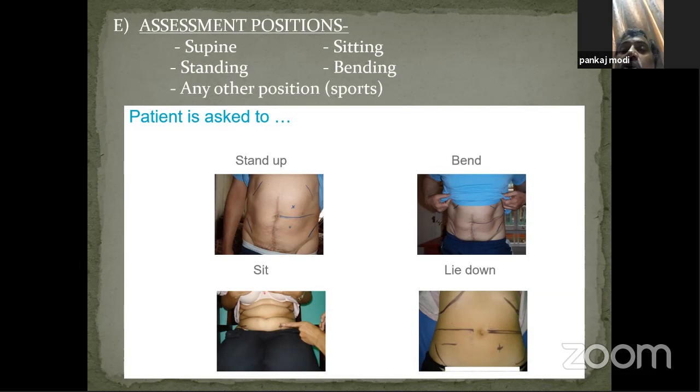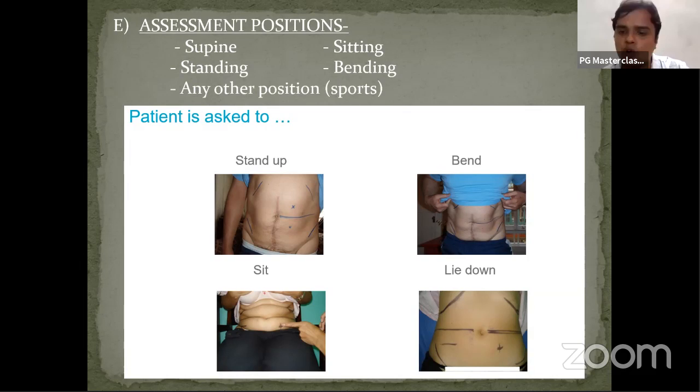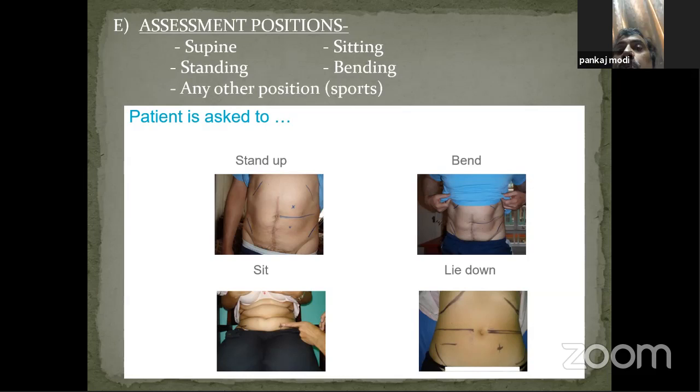You will not have time for drawing this line, that line. So how far away from the anterior superior iliac spine should a lower stoma be? It should be 4 to 5 centimeters away from the ASIS, sir. So there should be a space from any bony prominence after applying the probable stoma bag. Do you understand? So there will be space to apply the flange or the carrier or the stick-on stoma bag, whatever you use. After that, bone should not come in the way. That is a very important point. This is what is ideal, which is very difficult to follow in an emergency. Okay, what else?